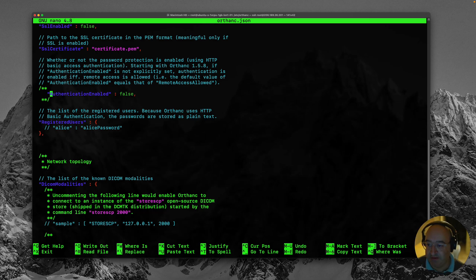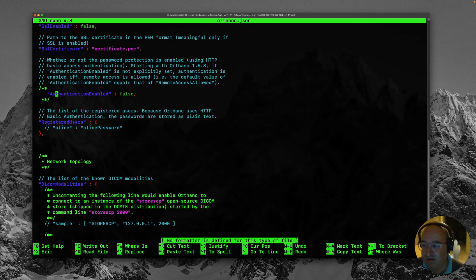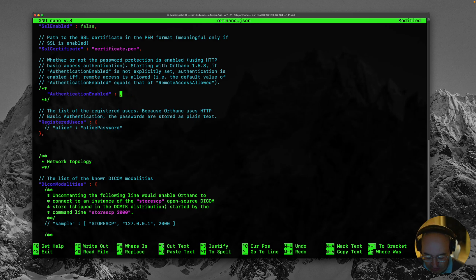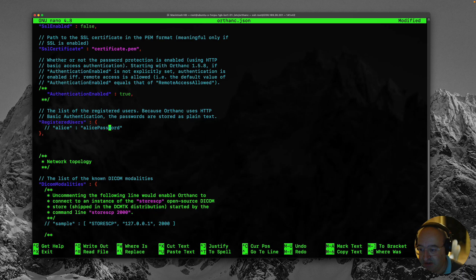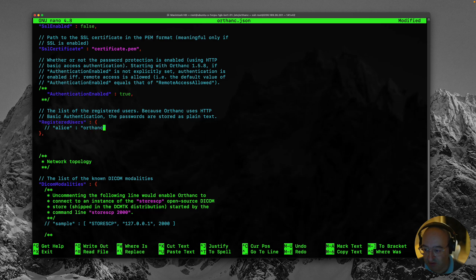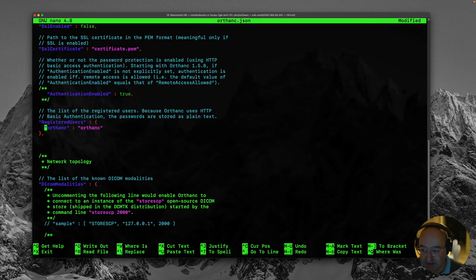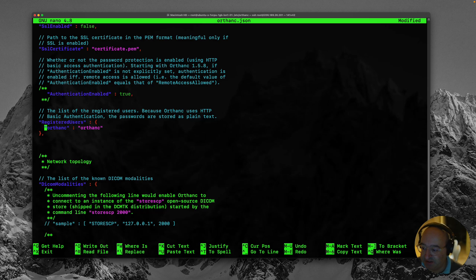Okay. So first thing I'm going to do. I'm going to just go to the end of the line. And I don't really know how to do that with shortcuts. But I'm going to change this to true. And then I'm going to create a user. So let's just have the password of Orthanc. Really insecure. And the user Orthanc. Again please don't use a rubbish username and password like this on a server which you leave live. This is just for demonstration.